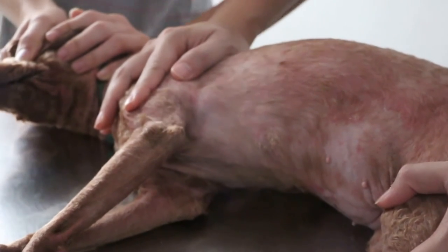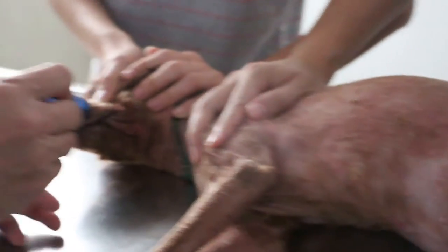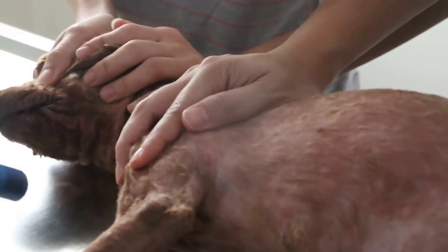December 20, 2014. I'm checking whether this dog has ringworm on the muzzle. I will flash the UV light here and start with this area first.